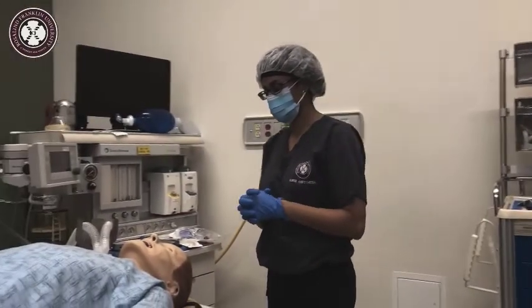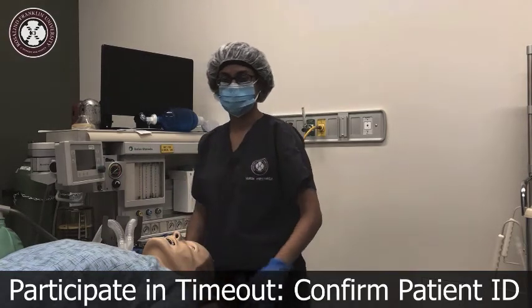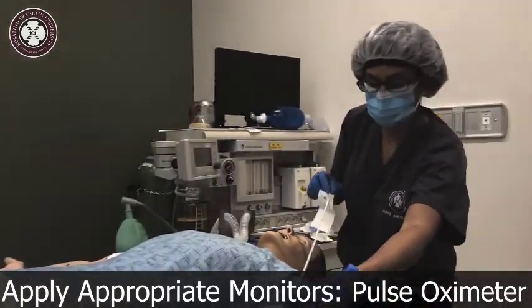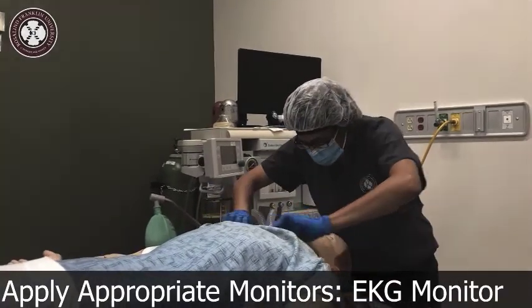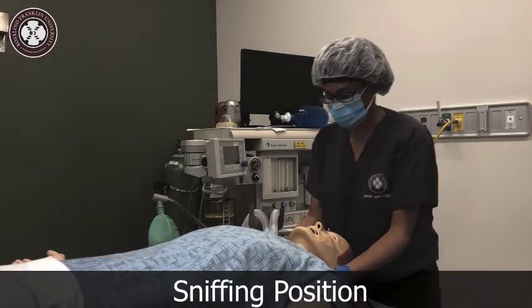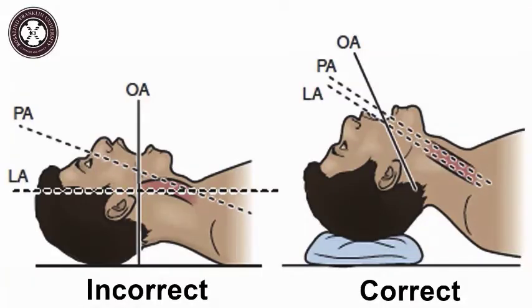When the patient arrives to the OR, it's necessary to participate in a time-out and confirm the patient's ID with at least two identifiers. Appropriate monitors should be placed on the patient to obtain baseline vitals. If there are no limitations on neck mobility, now is a good time to put the patient into the sniffing position by extending their head and flexing the neck.